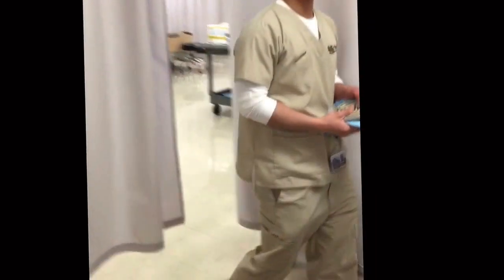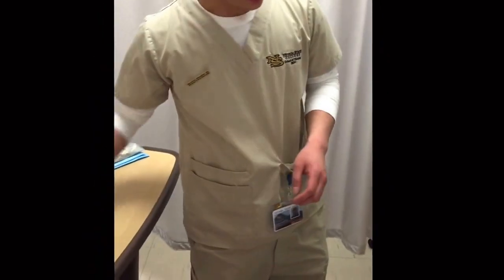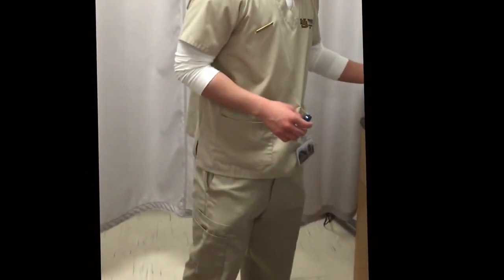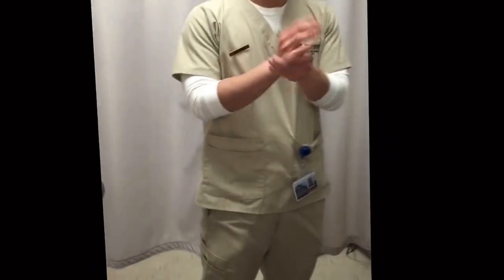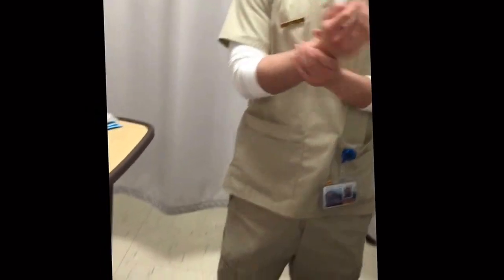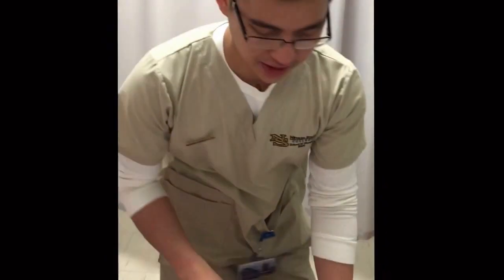Hello, my name is Michael Argerun. I'm a student from West State College. Just for hospital protocol, please say your name and date of birth for me, please. Yes. Susan Smith, 1964. Alright, Miss Susan, let me just double check your wristband.